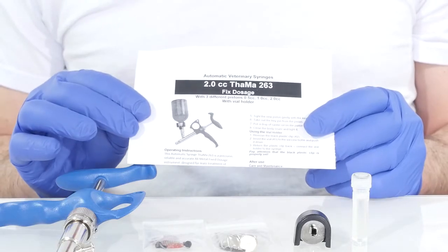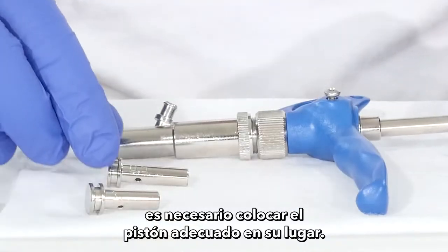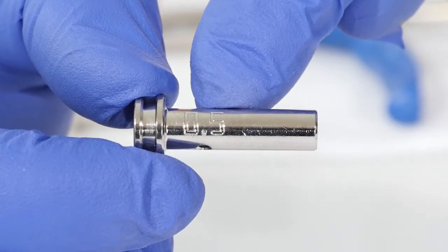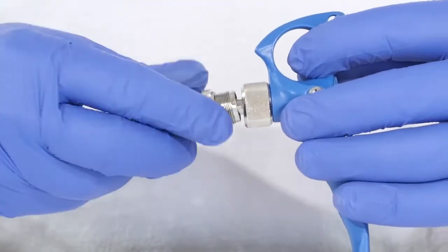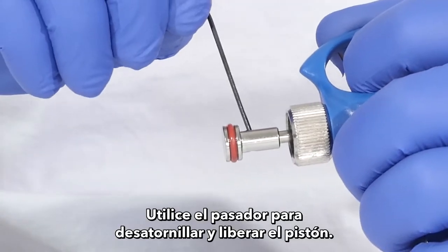Setting the dose: in order to set the dosage, you need to put the proper piston in place. Each piston is marked with its size. Open the syringe, then use the key pin to unscrew and release the piston.